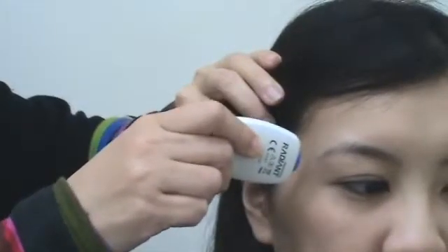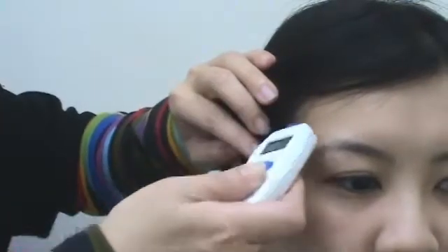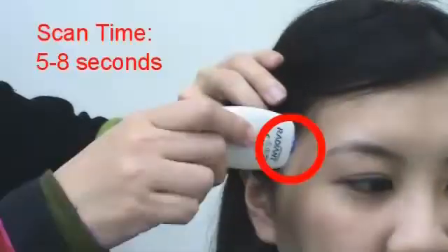Press the scan button and gently scan around the temple area. The measuring time might be between 5 to 8 seconds, depending on how long the thermometer takes to get the highest temperature.